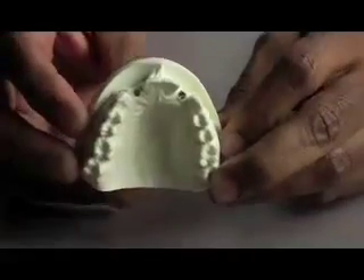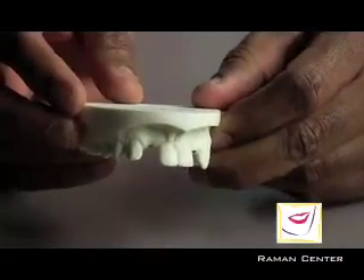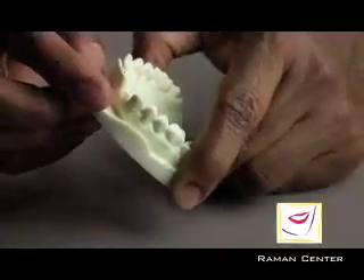This is a model of an upper jaw with two front tooth areas being empty. Traditionally, what would be done would be to cut the gum open and open it all up so the bone can be visualized.